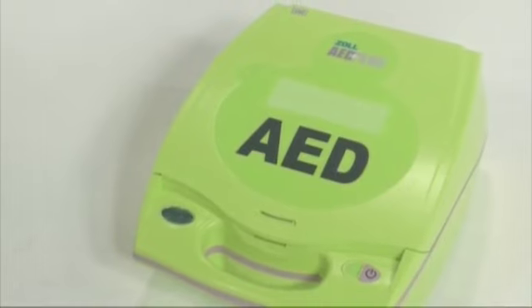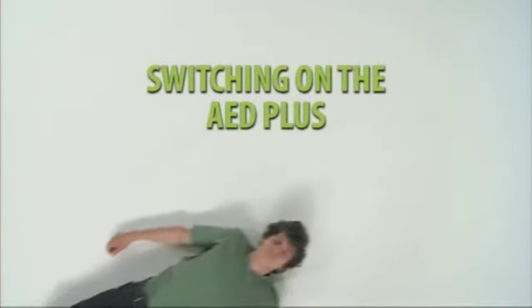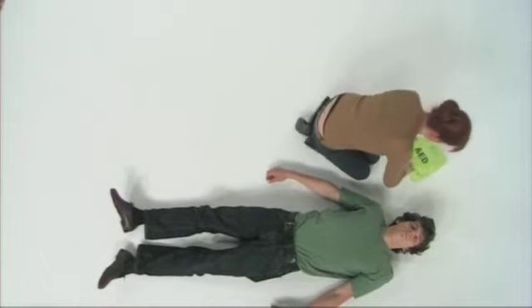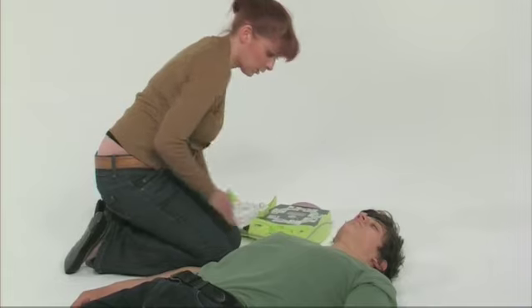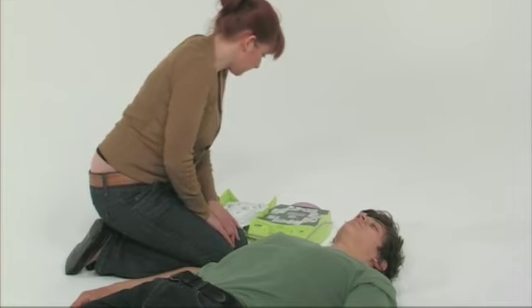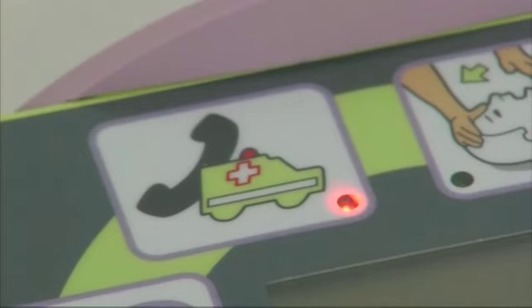We'll demonstrate how to set up and use the AED+. Upon reaching the patient, remove the lid of the AED+ and turn it on. Follow the reminder pictures, audio and written prompts through each stage of the life support process. An LED light indicates which step you should be focusing on.